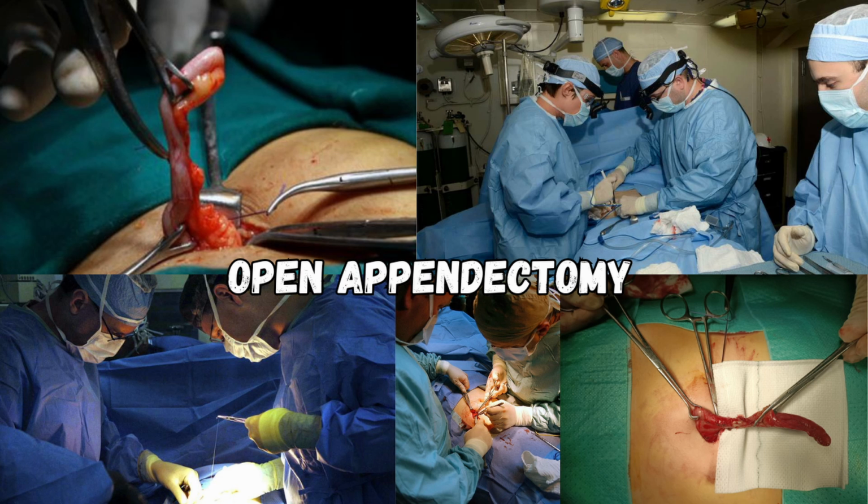Step 9. Closure. The peritoneum and muscle layers are reapproximated with absorbable sutures, using a Mayo needle holder. The external oblique is closed with interrupted or running sutures. The subcutaneous tissue is irrigated, and the skin is closed with staples or 4/0 nylon sutures. In contaminated cases, the skin may be left open to heal by secondary intention.